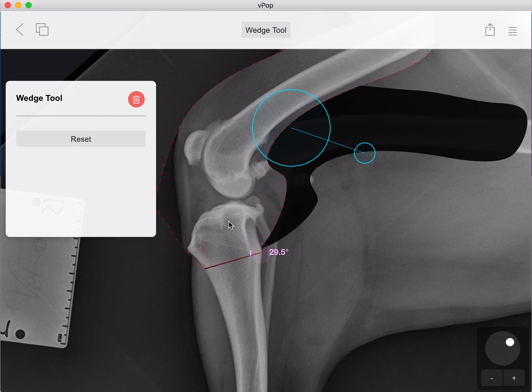So there you have it — that's the wedge tool in VPOP Pro, your veterinary preoperative orthopedic planner. Download your copy now from VPOPPRO.com. Thank you.